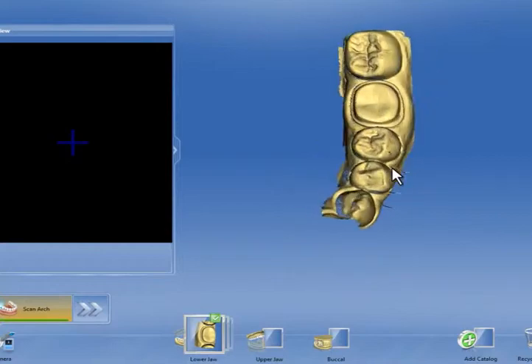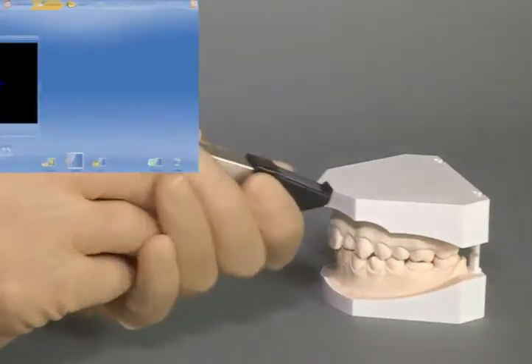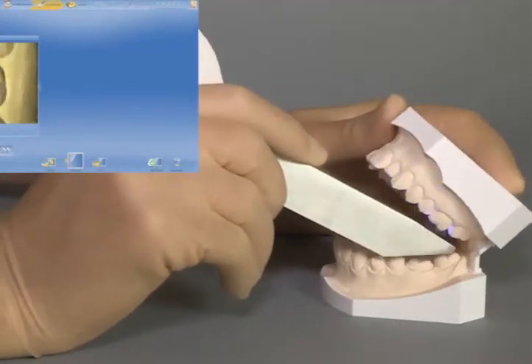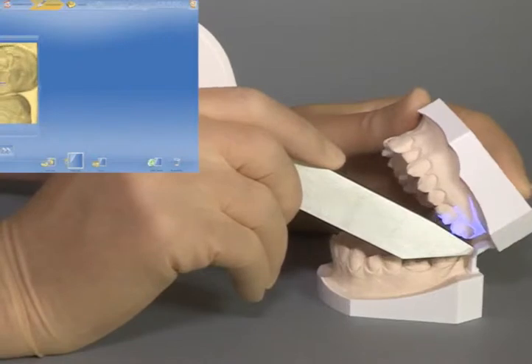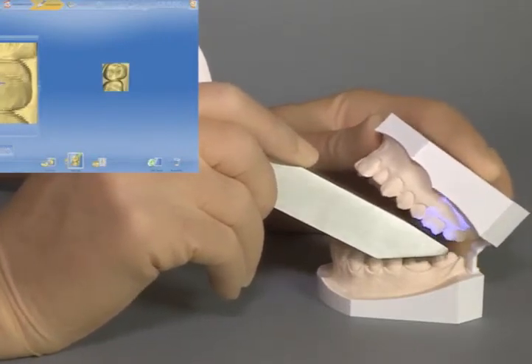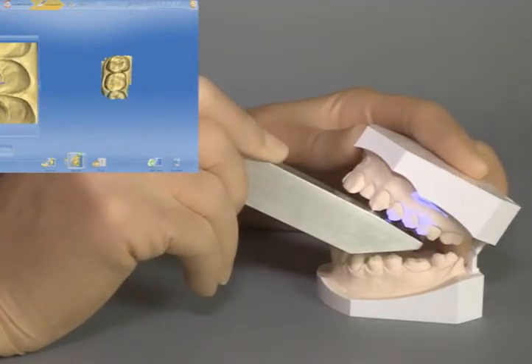We now check the model. Sometimes, with real intraoral scans in the dorsal part of the mouth, it is advisable to remove the support from the camera to allow better maneuverability. On the upper jaw, we also begin scanning distally with overlapping exposures towards mesial.